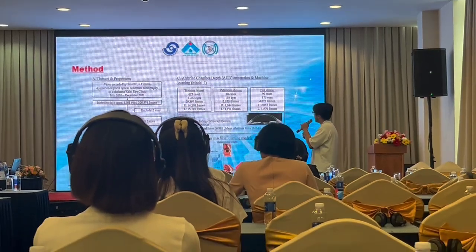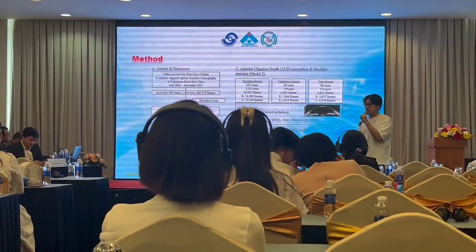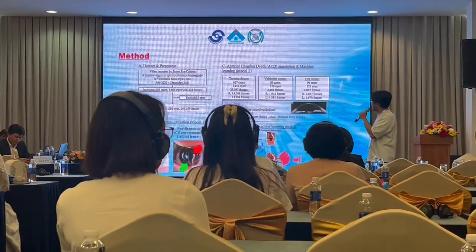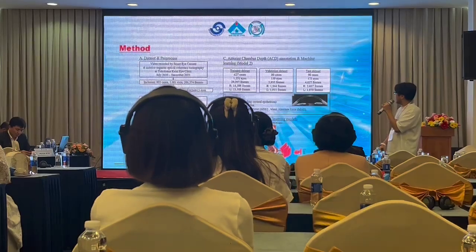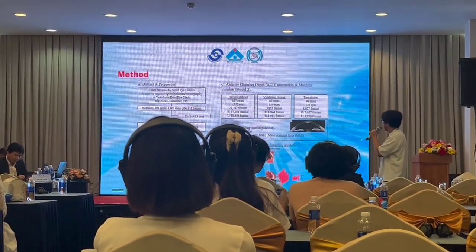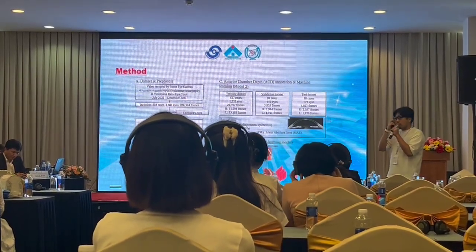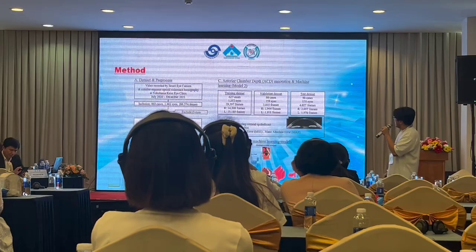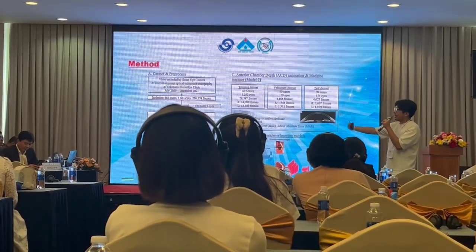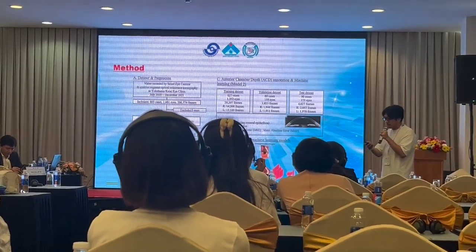With this model, only 37,000 images were included, and the other 167,000 frames, most of the frames, were excluded. Then, for those frames which are eligible for the study, the 37,000 frames, we developed the training, validation, and testing datasets, and acquired an AI model.